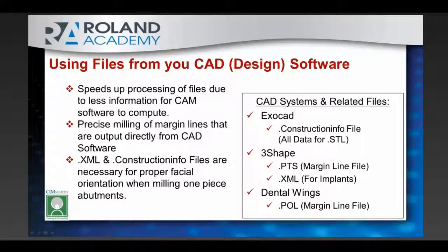A lot of these files you can get as part of the output options in your manufacturing output. If you're not sure how to access those, definitely contact the reseller of your CAD software, and they should be able to tell you how to output these additional files.